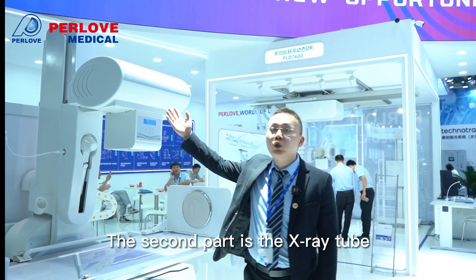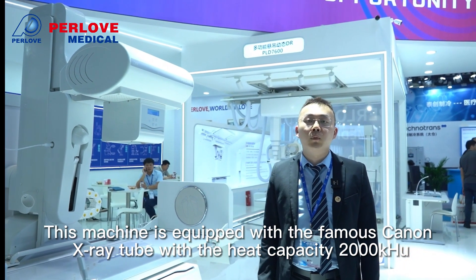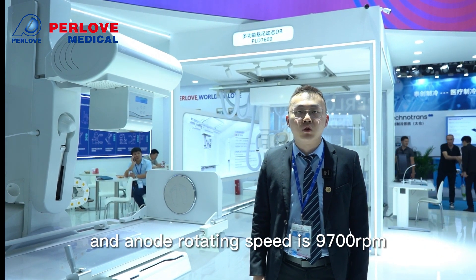The second part is the X-ray tube. This machine is equipped with the famous Canon X-ray tube, with a heat capacity of 2000 kHU and a rotating speed of 9,700 rpm.